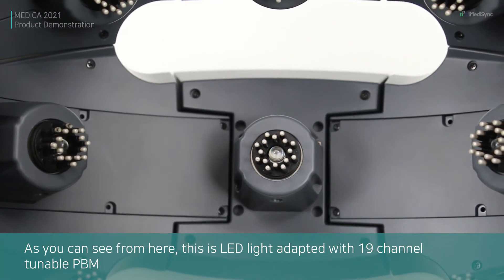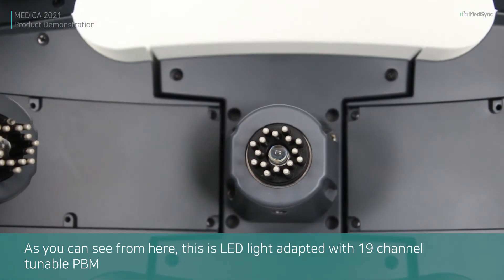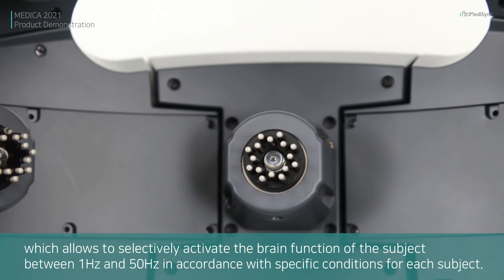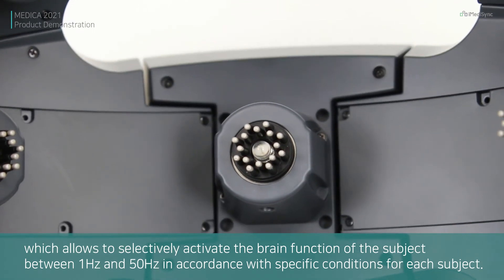As you can see, this LED light is adapted with 19-channel tunable PBM, which allows selective activation of the brain function of the subject between 1 to 50 Hz in accordance with specific conditions for each subject.